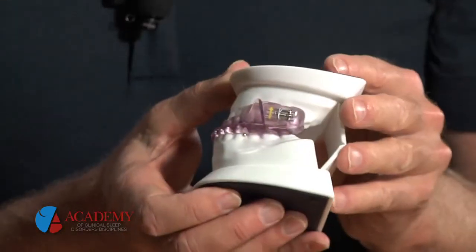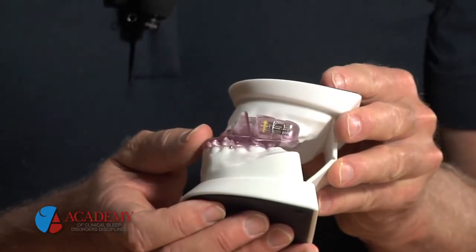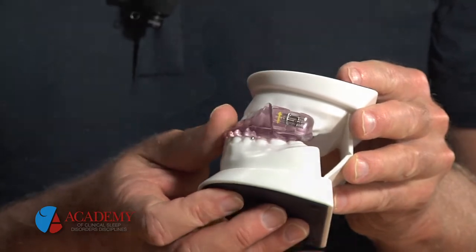This particular appliance, the SomnoMed, is probably the most popular appliance in the world. More of those are made than any other. It's the one I've worn myself for about the last 5 years. It has a piece that goes over the top and the bottom, and it stabilizes the jaw position through these wings on the side of the lower appliance, and you still have freedom of movement. You can get a drink, you can talk, you can answer the phone if you need to during the night, but it stabilizes the position there.